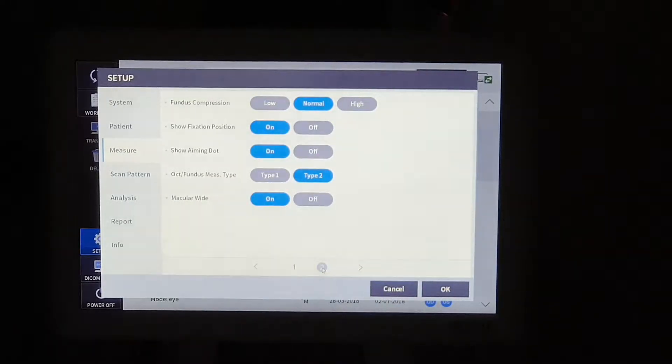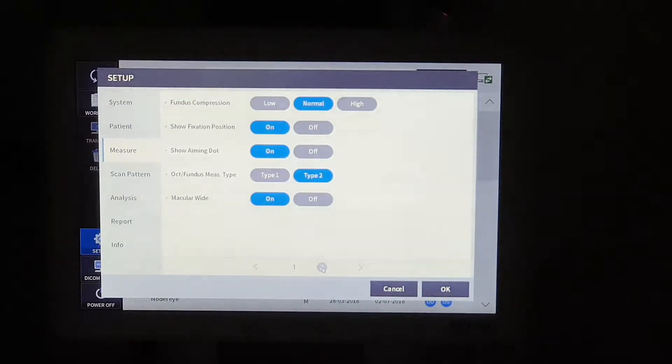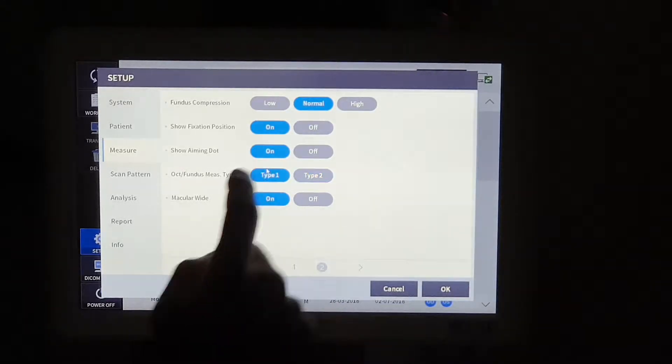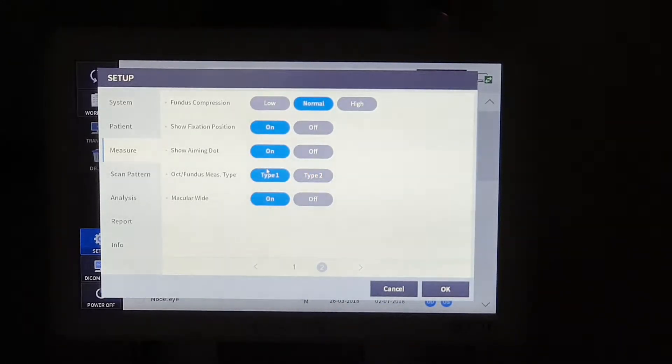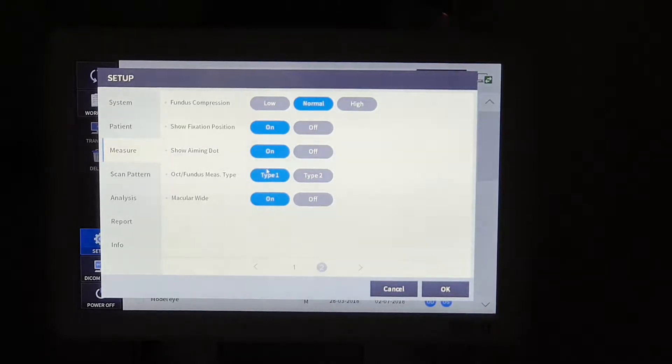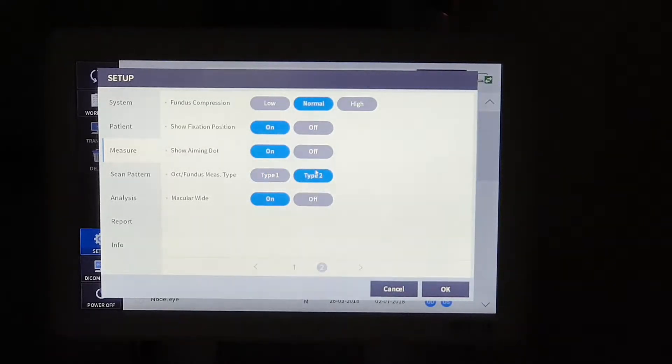We added new measurement type, type 2. In type 1, we take OST and fundus image at one time, but different from type 1, in type 2, we can take OST and fundus image separately.